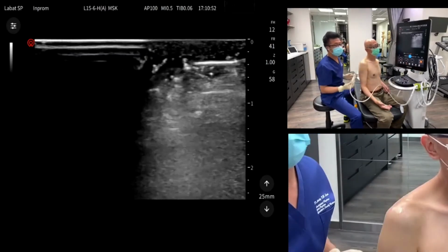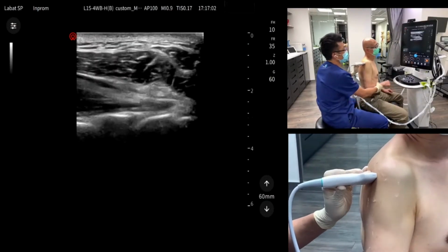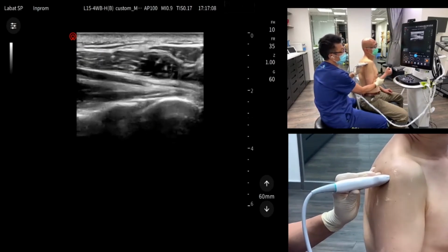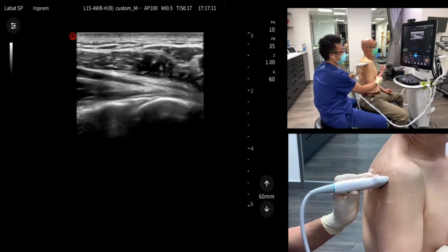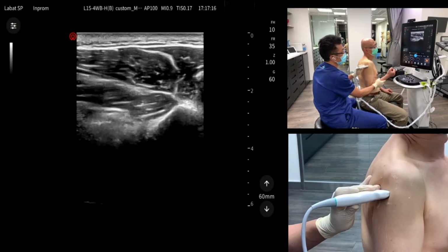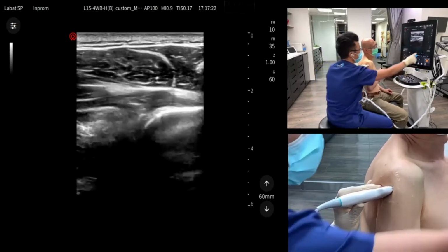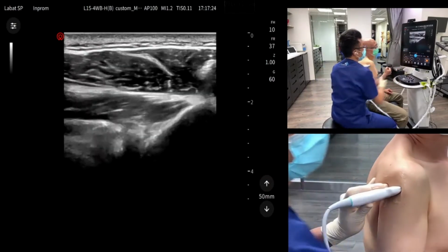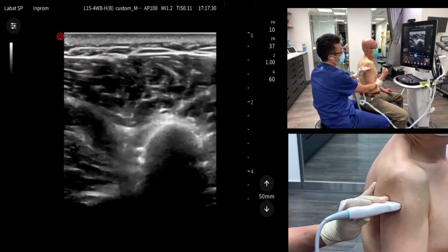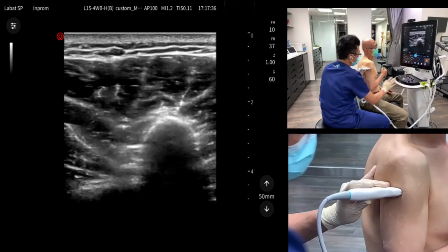Ultrasound-wise, we would like to see other structures like nerves. Okay, we are now at the posterior shoulder. We can do our posterior impingement test. But at this time, I would like to go underneath, and you can see this is the teres minor muscle in the middle of the screen. When we see the teres minor, the next muscle you're going to see, going underneath the humerus right here, is the teres major, and go to the front.